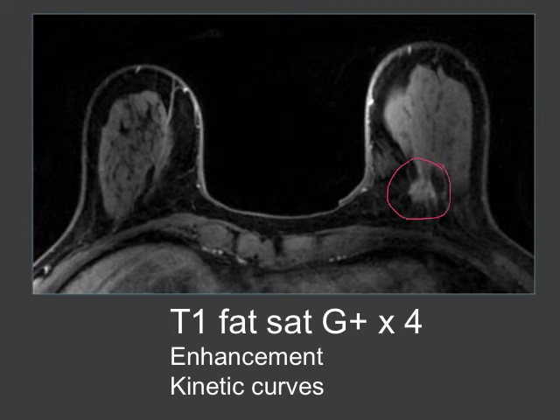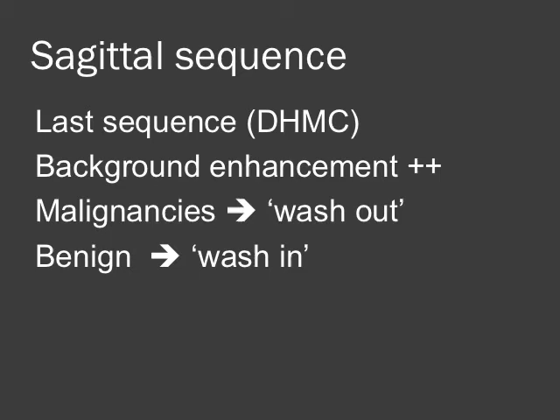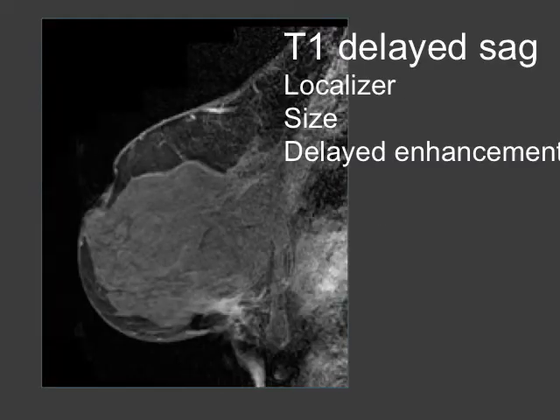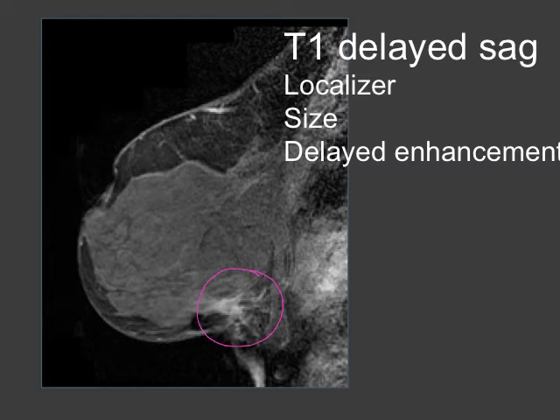Just notice here in this patient — you can see an enhancing spiculated mass in the deep posterior tissue of the left breast. The last sequence we obtain is the sagittal sequence. By this time there is often significant background enhancement, and malignancies in which the contrast tends to wash out on later studies may not be very apparent. Conversely, benign processes with progressive enhancement may become more apparent. Here is the sagittal sequence in this patient, showing that spiculated mass in the inferior aspect of her left breast. The T1 sagittal delayed image is very helpful for localizing lesions, giving another dimension to size estimation, and showing areas of delayed enhancement.